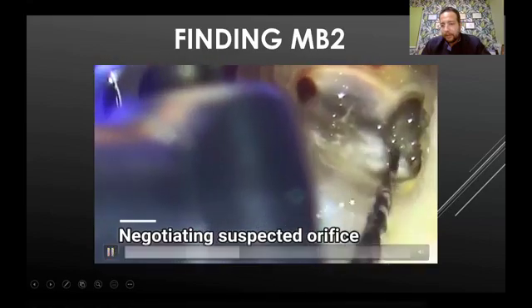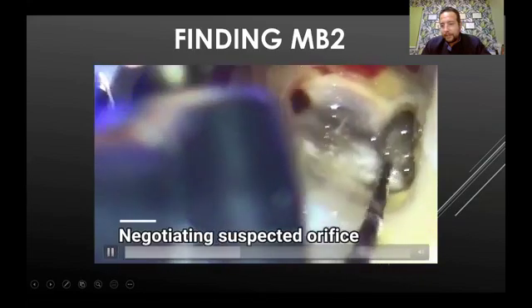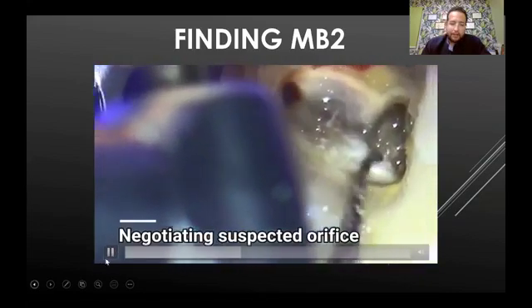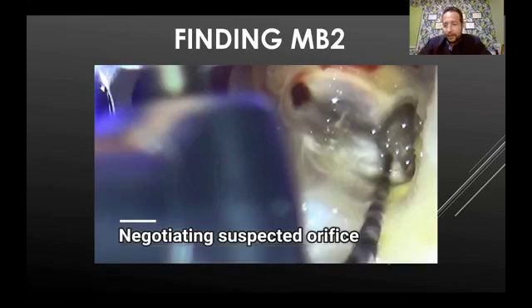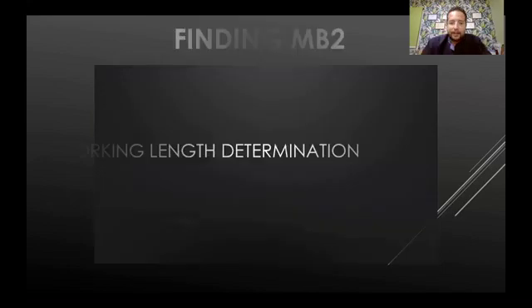Look at it, still there is some dentine on the orifice. I can't find a way. The advantage of using the orifice opener is it's a very big file, very strong, with a safe end. So you can see how it bends without penetrating the pulpal floor. If there is no canal, it's very safe to use. That's another way to use it.